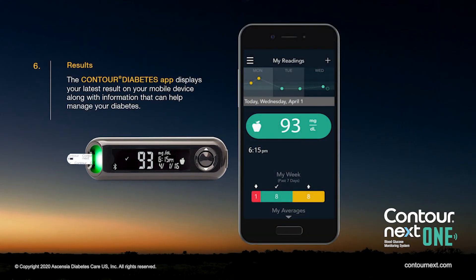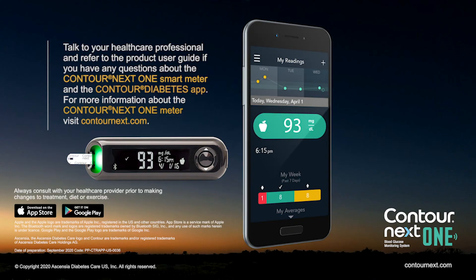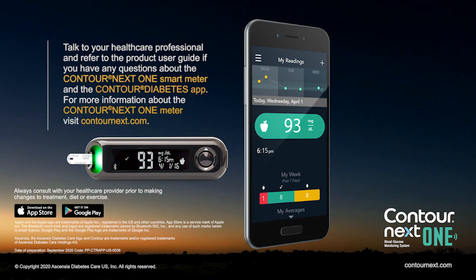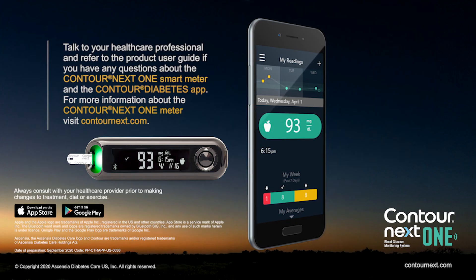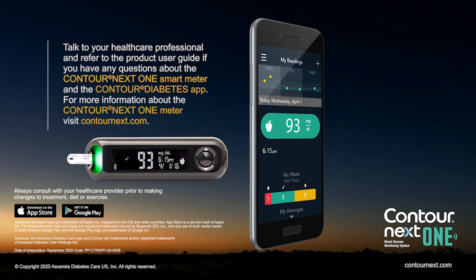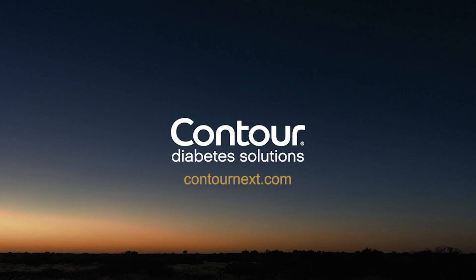The Contour Diabetes app displays your latest results on your mobile device along with information to help manage your diabetes. Talk to your healthcare professional and refer to the product user guide if you have questions about the Contour Next One smart meter and the Contour Diabetes app. For more information about the Contour Next One meter, visit ContourNext.com.